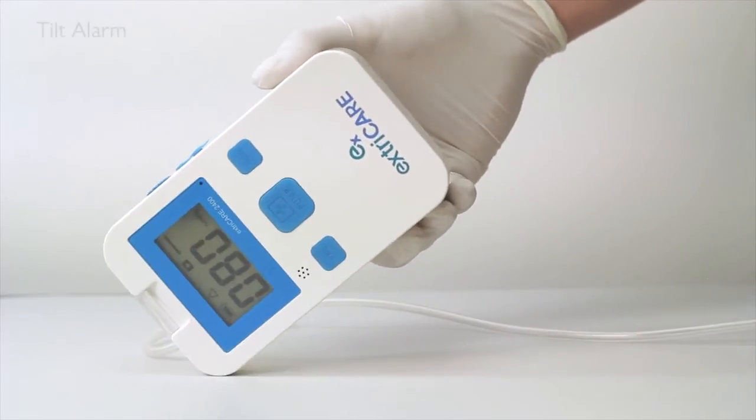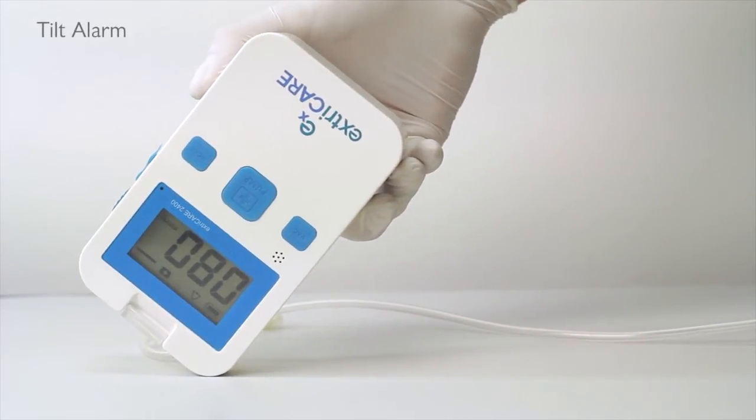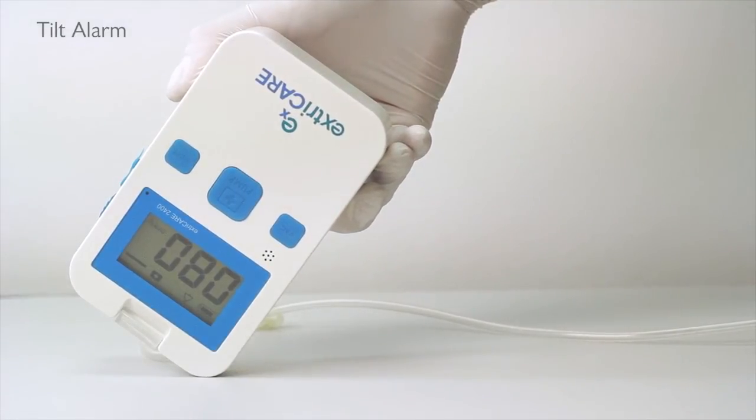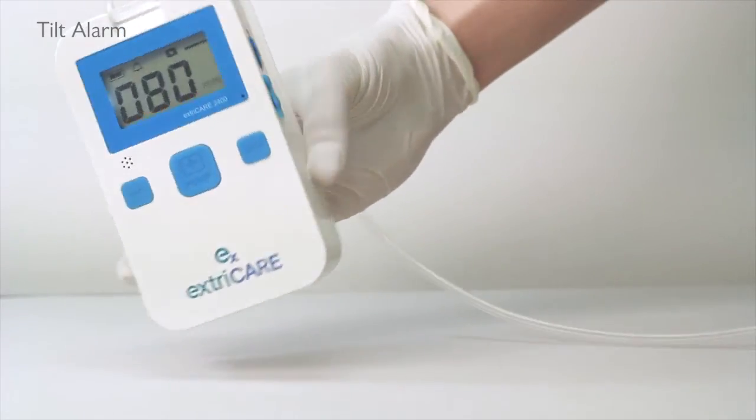If the ExtraCare is tilted more than 95 degrees for over 10 seconds, the device will sound an alarm and the yellow LED light will flash. If the device is tilted for more than 1 minute, it will stop operating. The system will not start up again until it is placed vertically for 3 seconds.